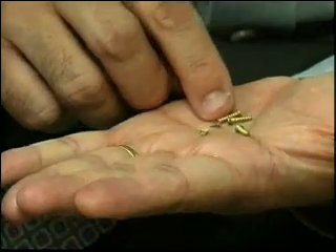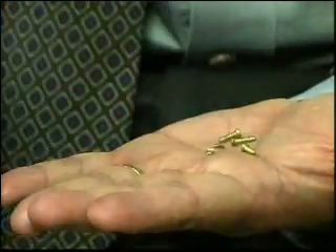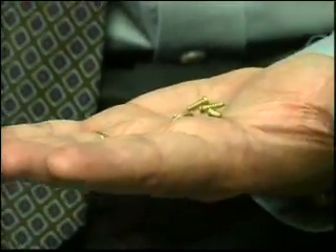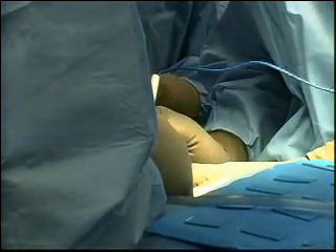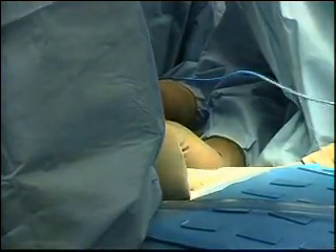After the coating is applied, a laser tests the ceramic surface for durability. In addition, Dr. Vora coats the screws that fix the implant to the bone with a mineral called hydroxyapatite. This allows for better bone integration, which should translate into fewer surgeries for patients.